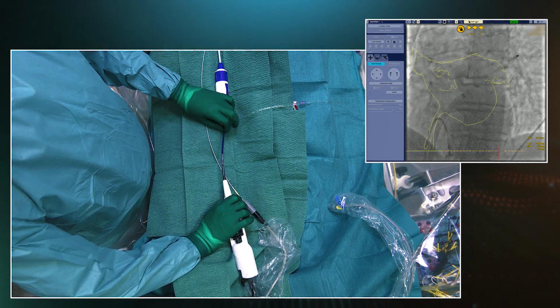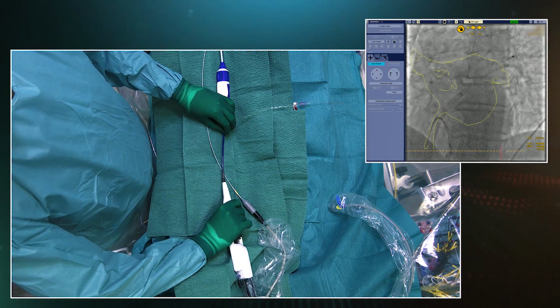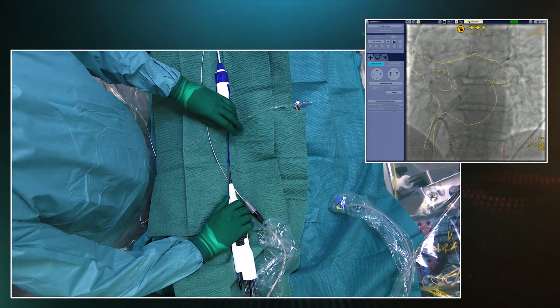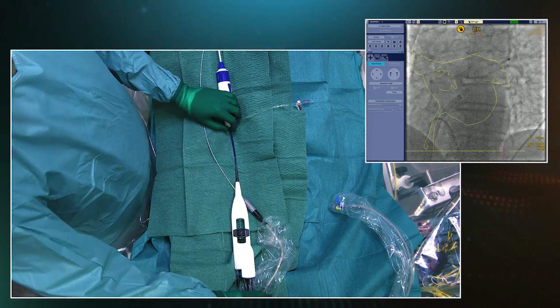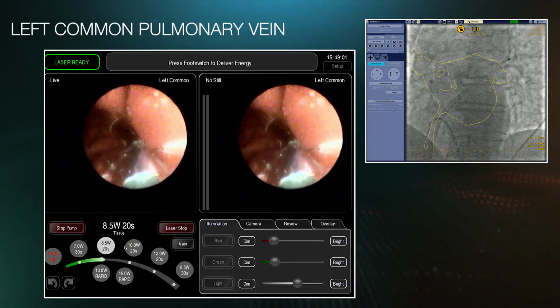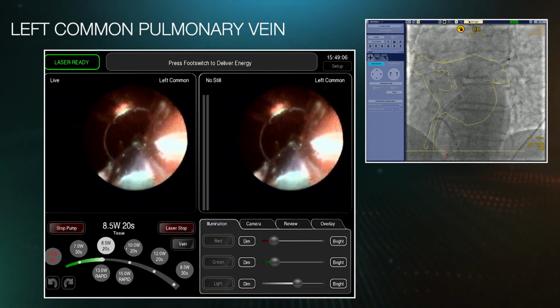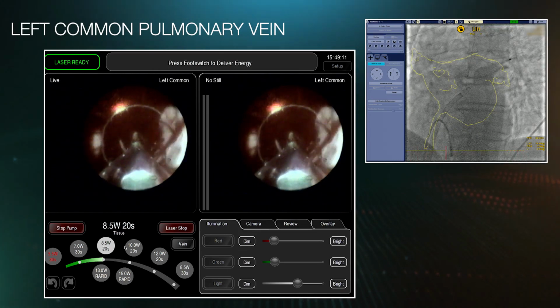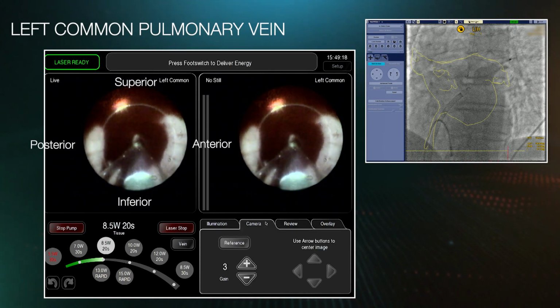And what I'm going to do with the marker for the orientation is I'm going to open the marker with its open end to the inferior aspect. So we have a good frame of reference for the camera view. It means the camera needs to be in the 6 o'clock position, and that's what just happened on the live camera view. You saw it. We rotated the camera so it matches the marker orientation, which means it's now anatomically correct, which means inferior is inferior, superior is superior, right side is anterior, left side is posterior.